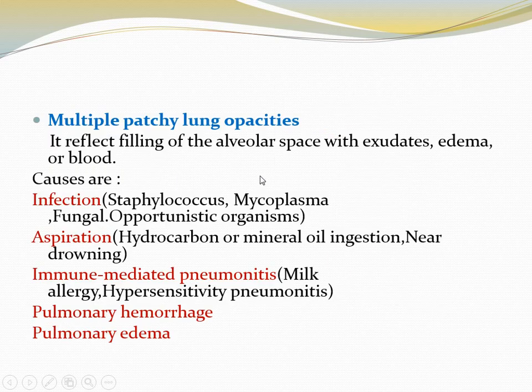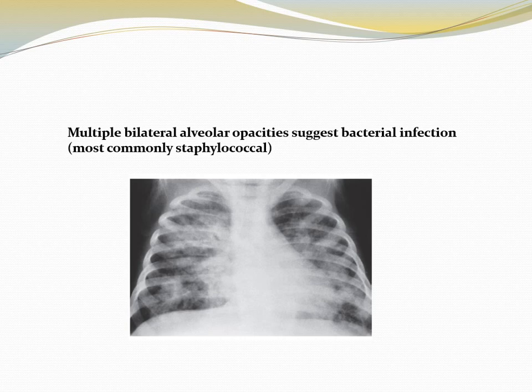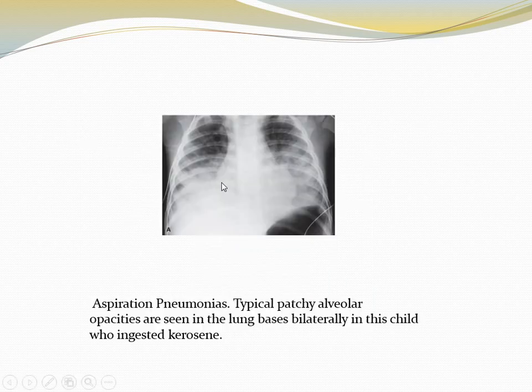Multiple patchy lung opacities reflect filling of the alveolar space with exudates, edema, or blood, caused by infection or aspiration, immune-mediated pneumonitis, pulmonary hemorrhage, or pulmonary edema. Multiple bilateral alveolar opacities suggest bacterial infection, most commonly staphylococcal. Another case shows multiple bilateral opacities more basally located in a child who ingested kerosene, so it is a case of aspiration pneumonia.